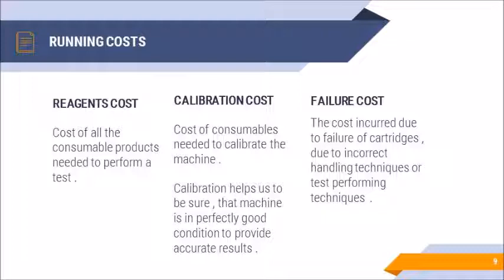Failure cost. Whenever new equipment is installed, there is a very high chance of failure due to incorrect handling or incorrect performing techniques. So it's important that this cost is taken into the picture initially, for the failure of cartridges, because it can be incurred during the training phase of the user.